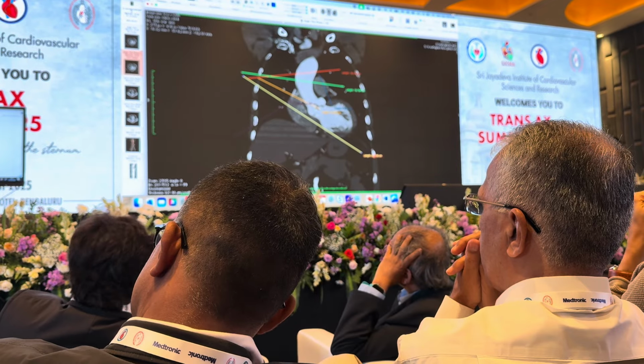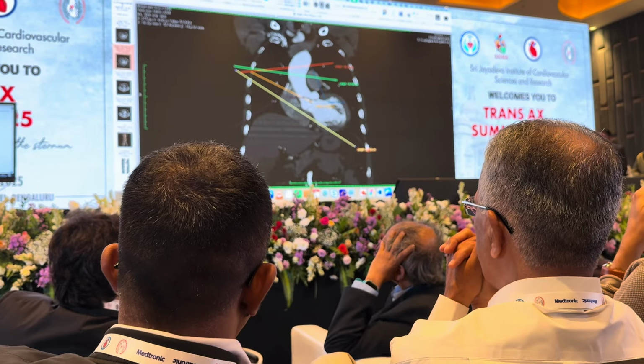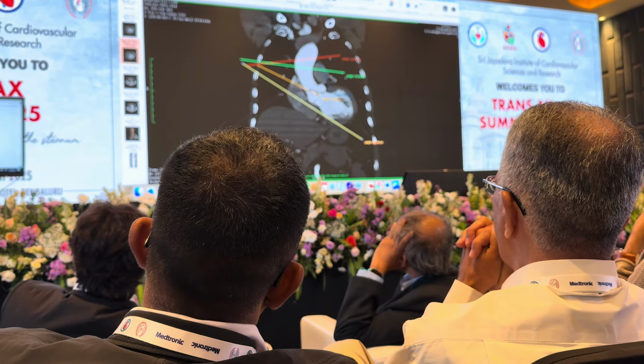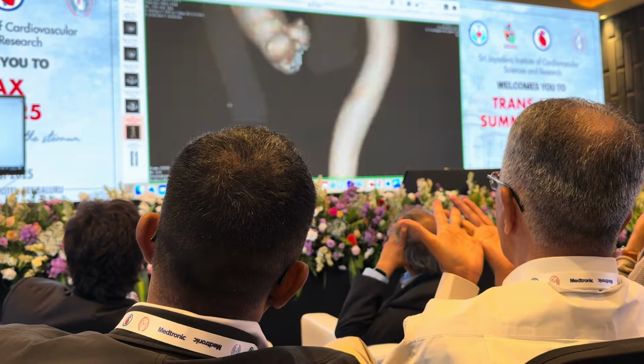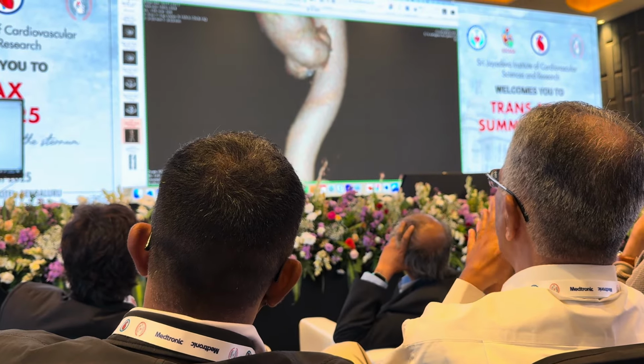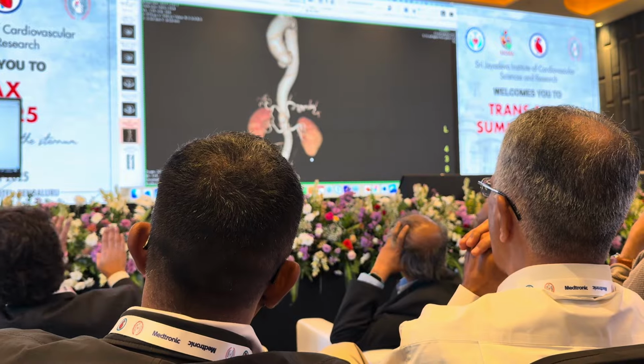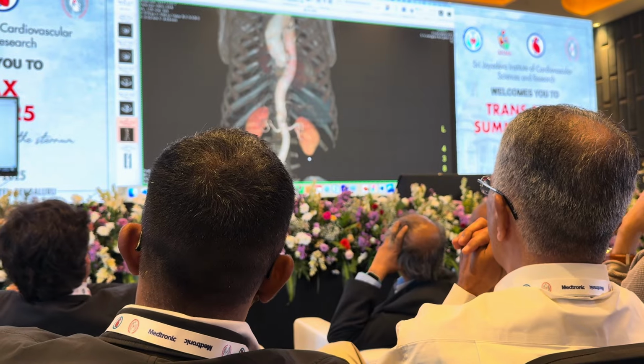Of course, and I see here the radiologist, that this can be even more sophisticated, even more. Is this the one? Let me zoom out. You know, with here, can you see it?